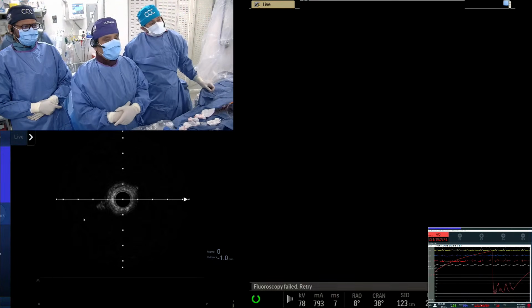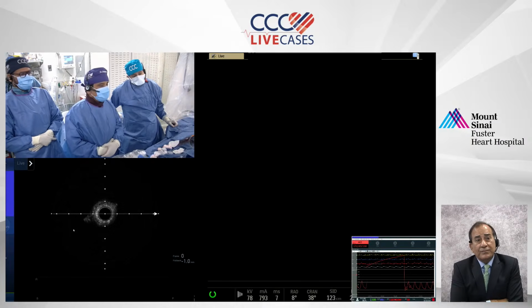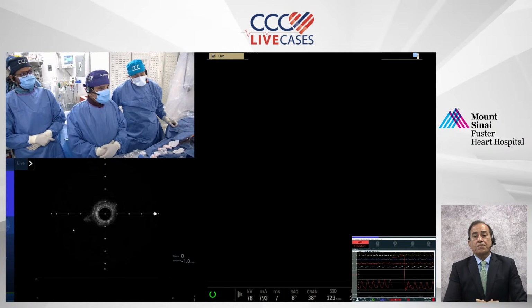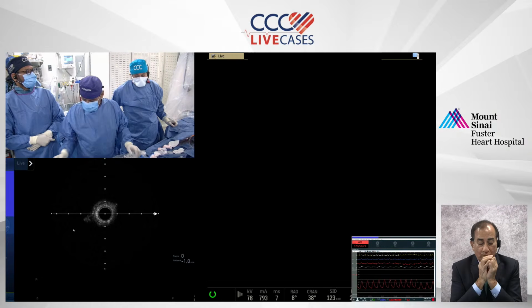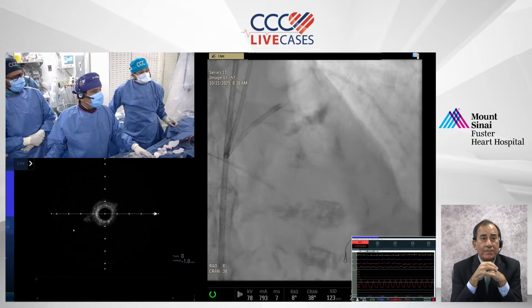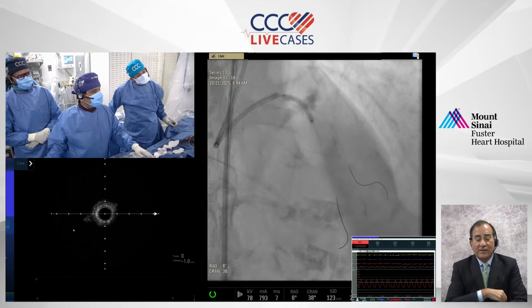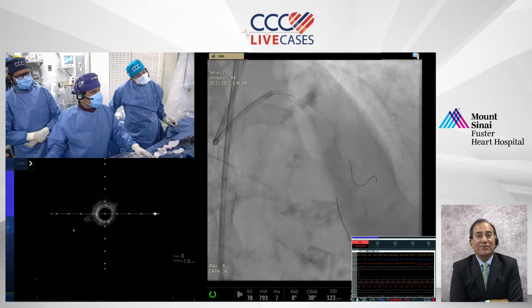One of the observations I have: IVL will not go. That's why I said, can we just pre-dilate, do IVUS again and do IVL? We are showing how live cases are normally done, compared to what we would have done with the fellows here. Another lovely observation: IVL has virtually no learning curve compared to Rota.